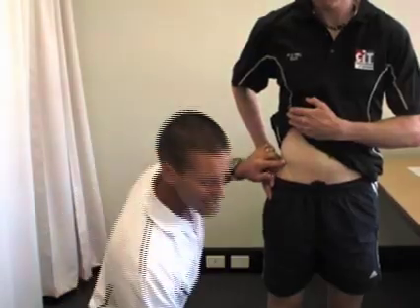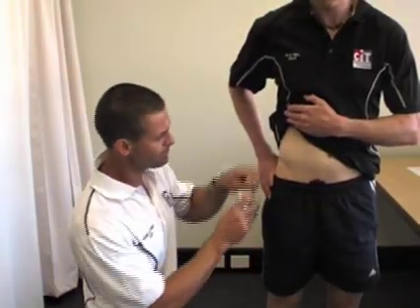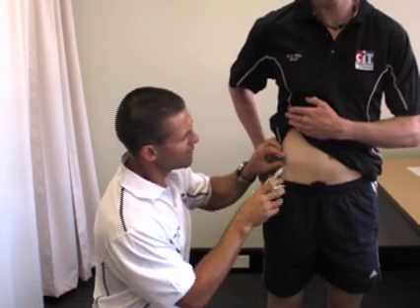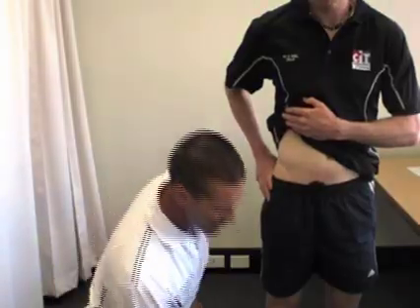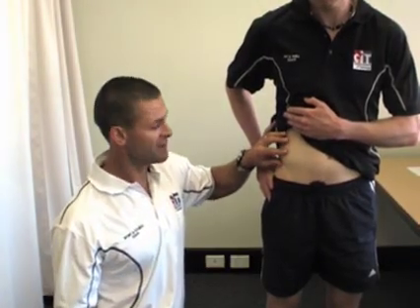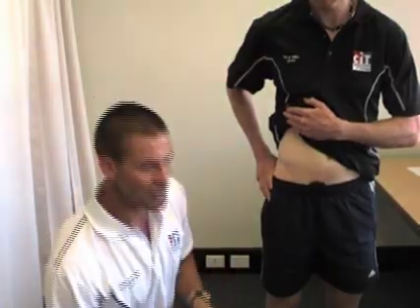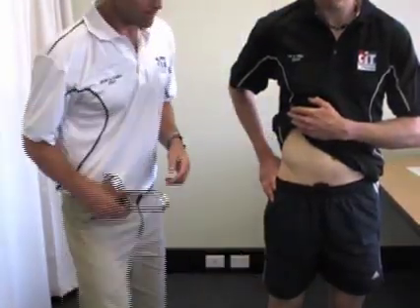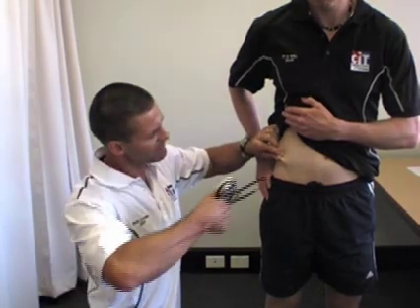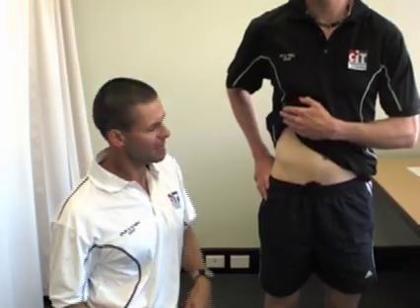For males, the suprailiac is 10mm above the iliac crest. So I simply take my tape measure, find the top of the iliac crest, and make a mark 1 centimetre above it. The female iliac crest skinfold is 30mm above the iliac crest. We want to make sure we take the skinfold in the same line as the iliac crest. Where that mark is, we simply grab the skinfold, apply the calipers, take the reading which is 4mm, then release and rub off.